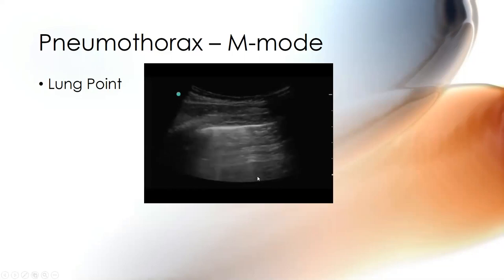What would create this potential appearance that is not a pneumothorax? That's normal. It's not a very fair question. You could say atelectasis is normal, but I'm going to say totally normal. Lobe occlusion, agree. Some of these things can show you where lung is or is not. But I would say that a lobe occlusion is not normal. It's not fair.